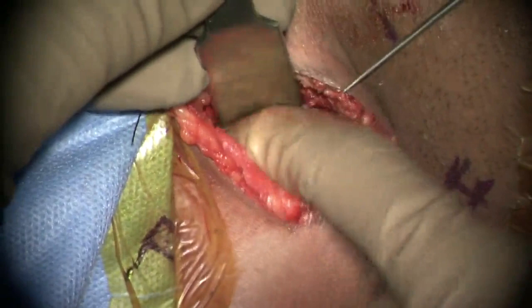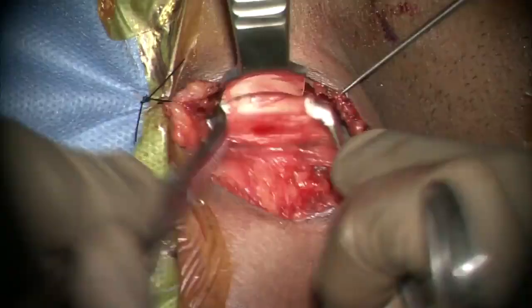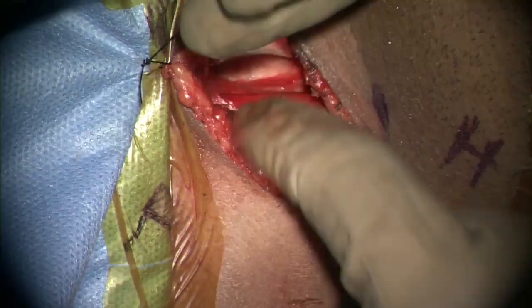The internal carotid artery pulsations are palpated and the dissection continues between the viscera — that is, the trachea and the esophagus on one side — and the carotid sheath on the other side. The dissection can be done bluntly using a finger or two peanut sponges.